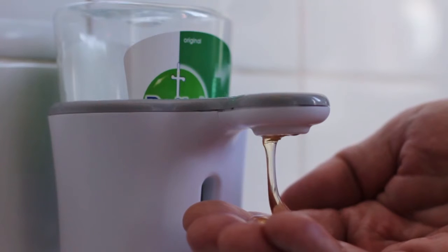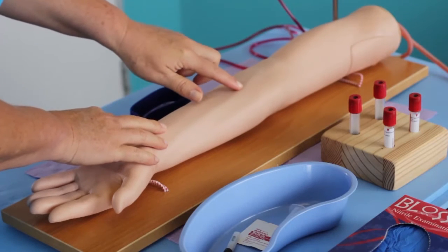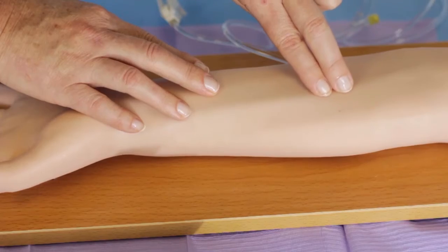Perform hand hygiene. Select the site by inspection and palpation, preferably at the cubital area.